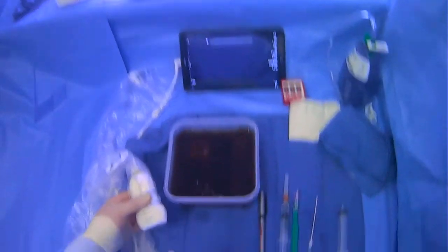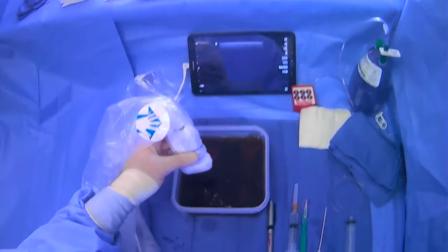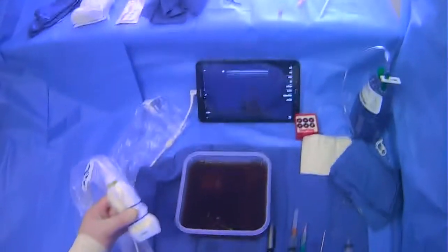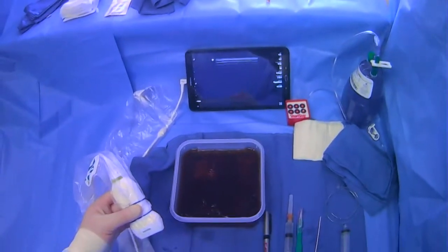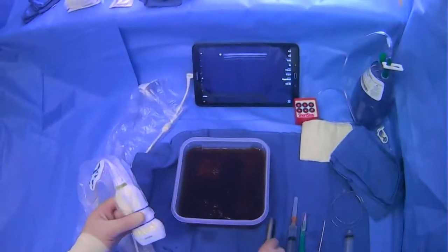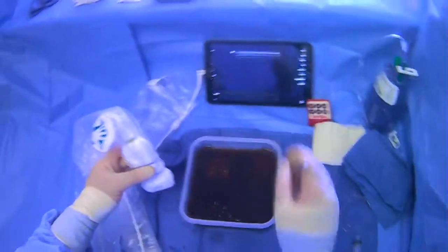If you're not already using the linear probe, you'll want to switch over and scan the subcutaneous structures with either color or power Doppler, just to get a sense of whether there are any vessels in your anticipated trajectory that would be dangerous to go through with the needle. Do all of that beforehand. Then when you know your trajectory, take a pen and mark it.